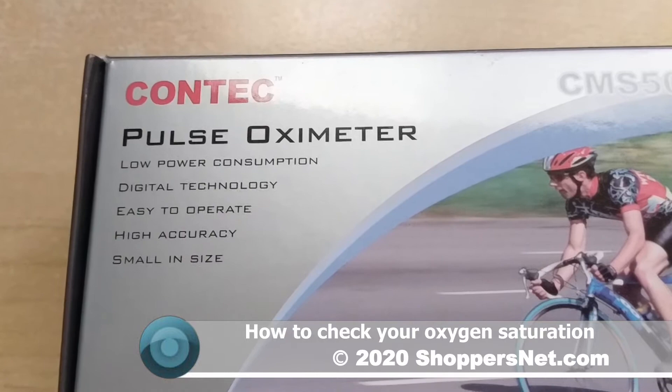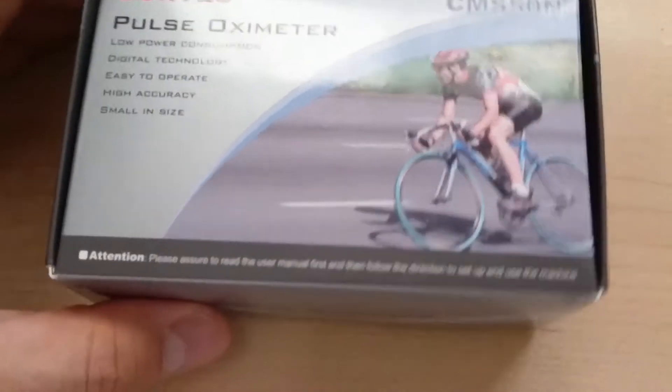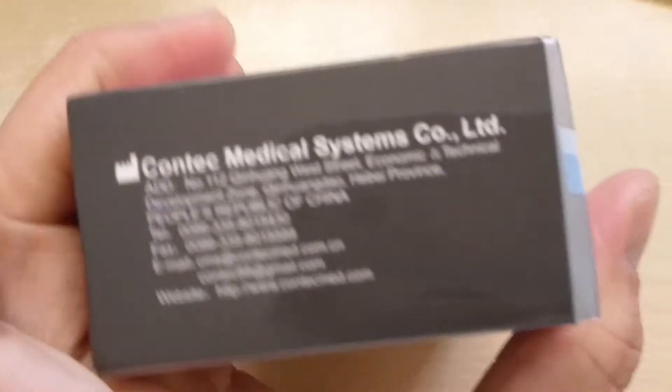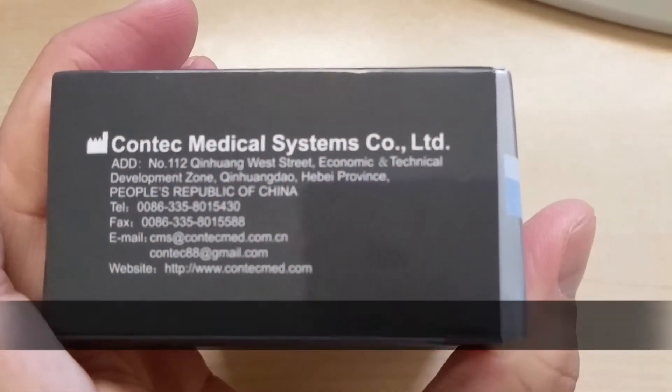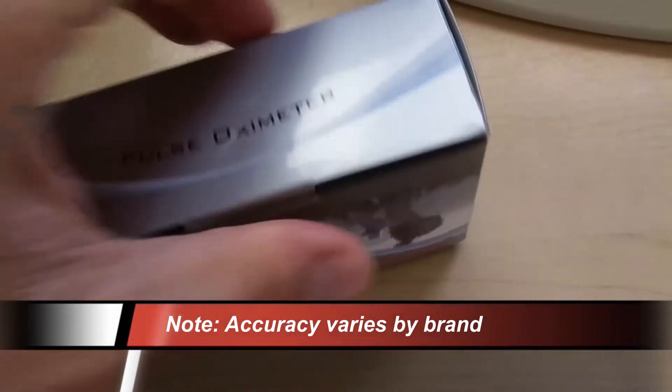This one's from Contec and they claim it uses low power consumption and has high accuracy, so those are key things we're looking for. Contec Medical Systems is the manufacturer of the one we're using, but you can find other ones online if you shop around.